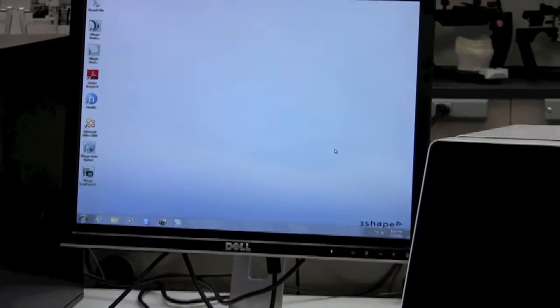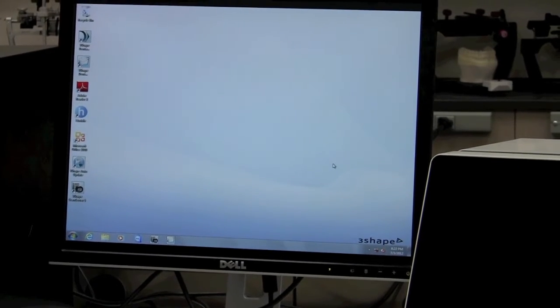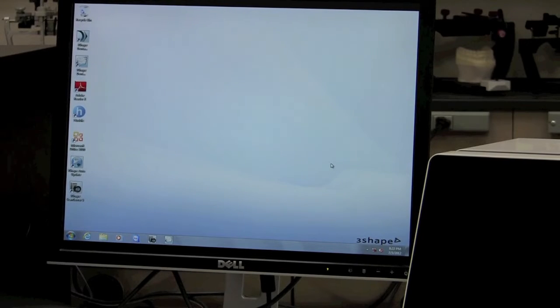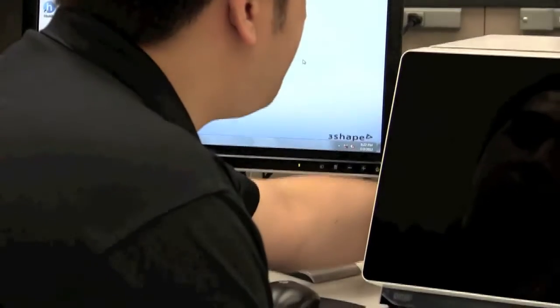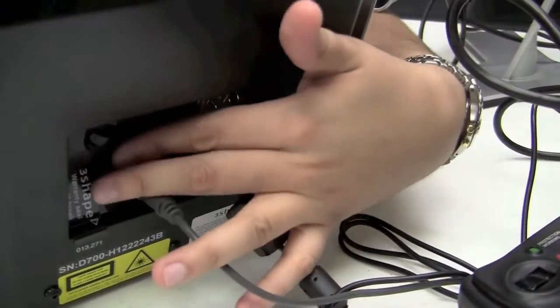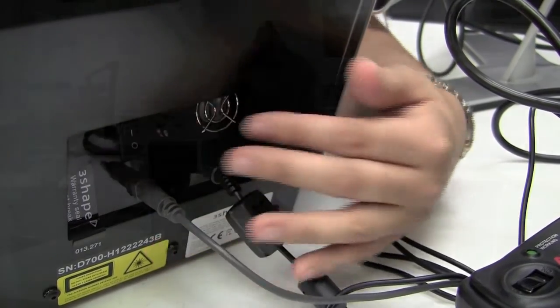Once you're satisfied that Windows is completely open and any additional background applications are running, reach around to the back of the scanner and switch it to the on position. Flip the power to the on position. Immediately upon turning the power on, you'll notice a small hum coming from inside — that's the exhaust fan on the back of the scanner.